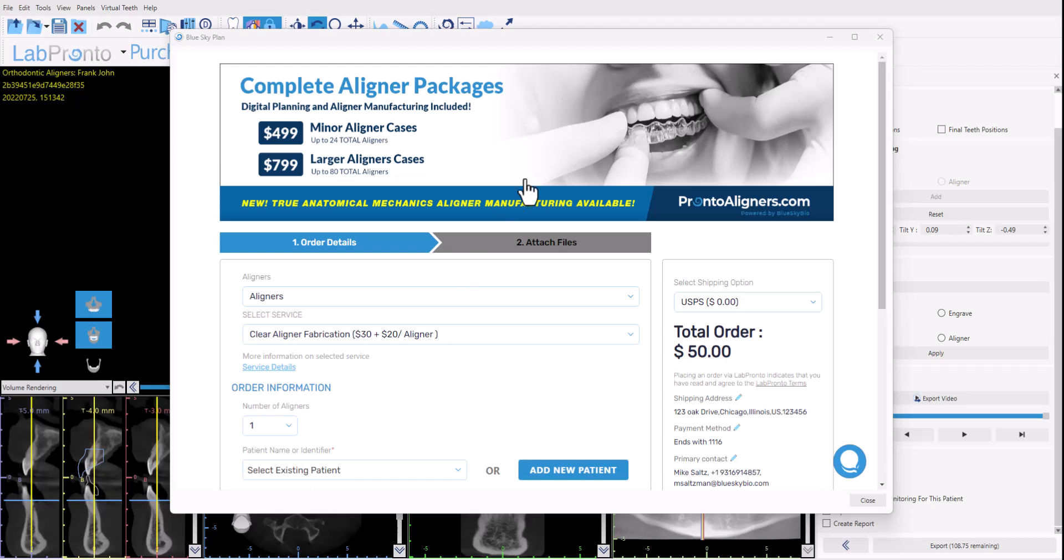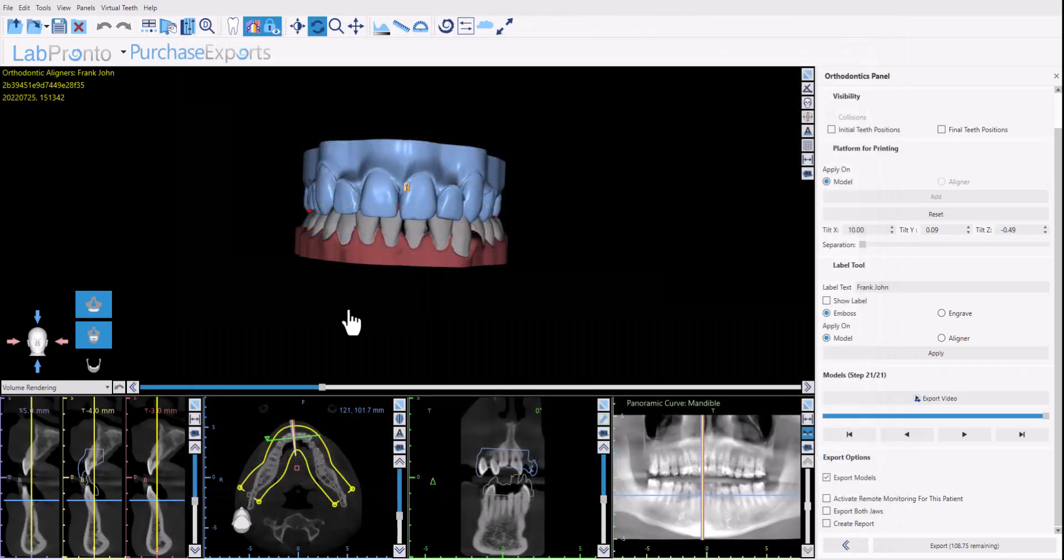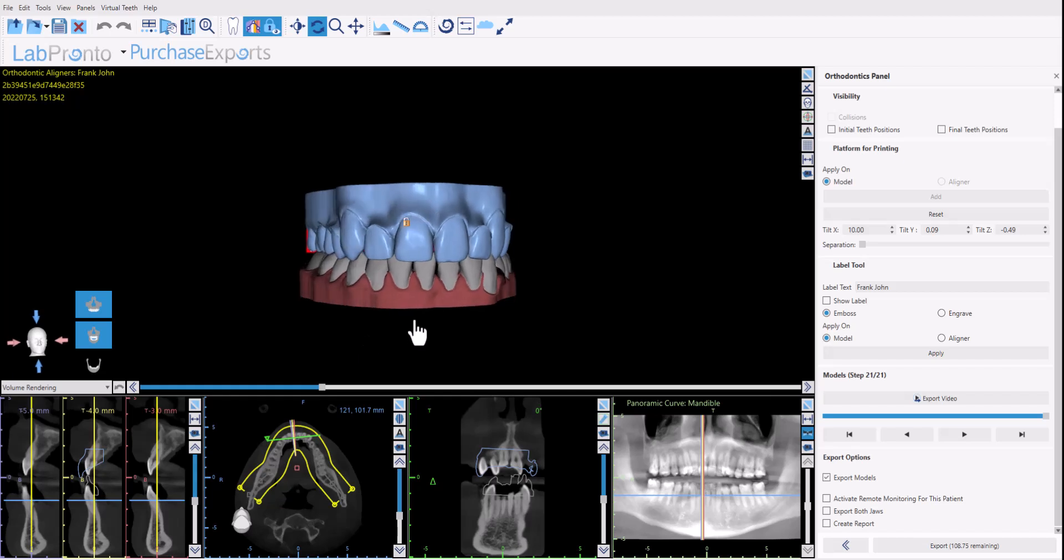So this is a very quick and streamlined option for users that want to do their own planning but want help with the manufacturing. Just complete the order form and the aligners will be manufactured and sent to you. I'm going to click close. Yes, that's okay. Okay, so let's take a look at the different capabilities that we have. Let's take a look at the panel on the right hand side of the screen.